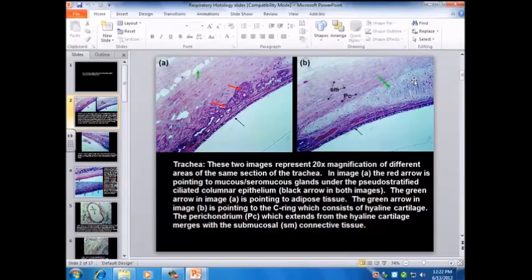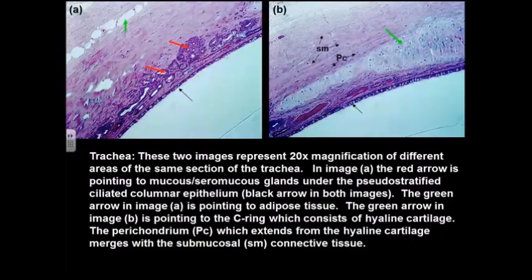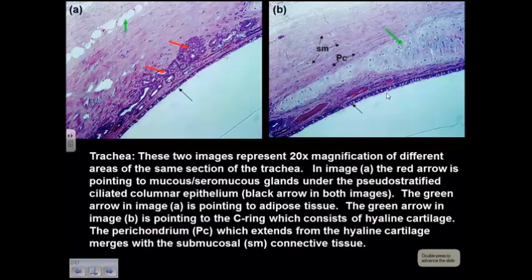In the trachea, you have the cartilaginous ring. You have pseudostratified ciliated epithelia that lines the inside. Here's some adipose. Here's some glands that contribute to the mucus. And these little tiny cleared out areas in here, these little tiny light areas right there, those are goblet cells that contribute to mucus secretions as well.